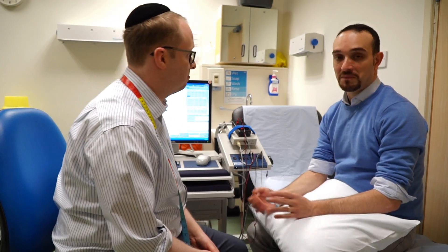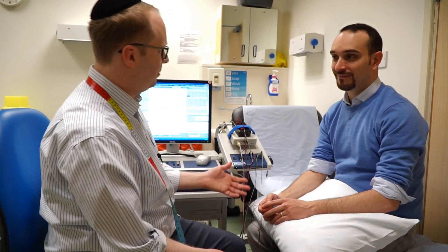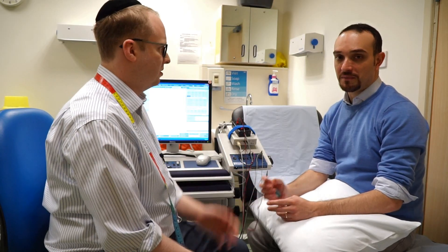And that's the end of the test. So hopefully you've seen it's a very quick test. Paolo, how was that for you? No pain at all. It can feel a bit uncomfortable — just a tiny bit — but nothing much to really worry about.